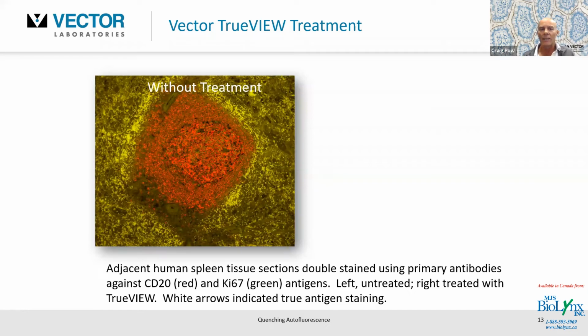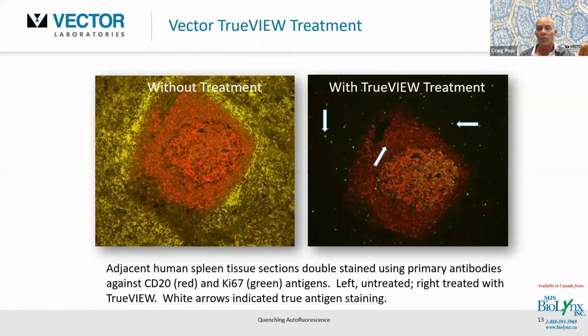So what does this particular section look like when, as a double label, when treated with TrueView? And these white arrows here certainly show you these green dots, the starry sky, one of our colleagues mentioned, is actually true staining for Ki67. And the other arrow here showing you this red staining for CD20. So if you look at these, compare them, obviously it would not be practical to identify Ki67 in this untreated tissue.